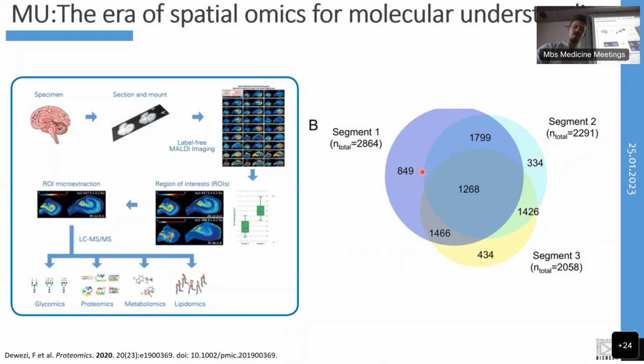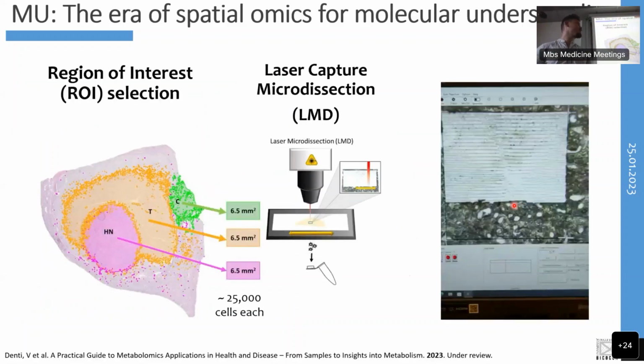In each of these cell clusters, they generated a large number of proteins that were specific for that type of cell. All types of information that would have been lost if you used immunohistochemistry or histology as a guide, or performed bulk omics analysis where you mixed all of this tissue together and lost some of this spatial context. And again, within our laboratory, this is something that we've also recently established, but at a lipidomics level. So rather than using proteins as a guide, we've used lipids as a guide to highlight regions of tissue which are appropriate for this laser capture microdissection.